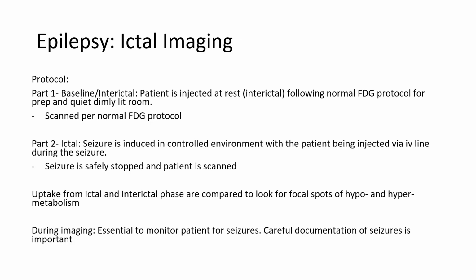They should just be placed in an area where they can recover from the seizure. Then uptake from the ictal and interictal phases are compared to look at any areas of focal hypo- or hypermetabolism.